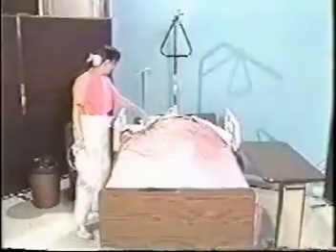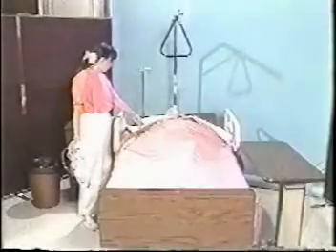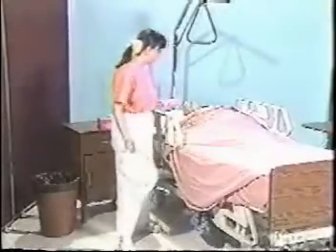Empty the urinary drainage bag in the bathroom and record your output. Clean and store according to facility policy. Remove your gloves and wash your hands. Reverse these steps to reconnect.